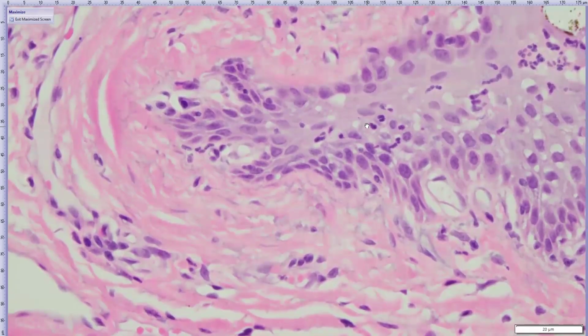And another thing that's kind of interesting in this case is the corneocentric distribution. The one thing in this case is that there is significant conjunctival involvement as well. In fact, I didn't reveal it earlier, but this patient had a smaller biopsy earlier on in the conjunctiva that also captured this neoplasm. So this neoplasm probably started in the conjunctiva and extended into the cornea from there.